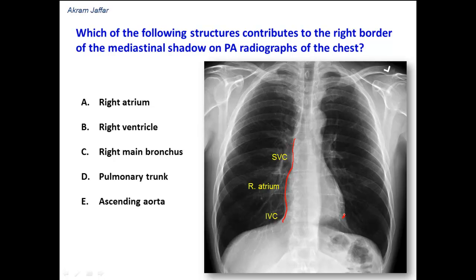On the left side, we have the apex of the heart, and the left border here is formed by the left ventricle. Then there is a small area here which represents the auricle of the left atrium, and then another region for the pulmonary trunk, and then, as you can see, the aortic knuckle which represents the arch of the aorta. So, this is the mediastinal shadow.